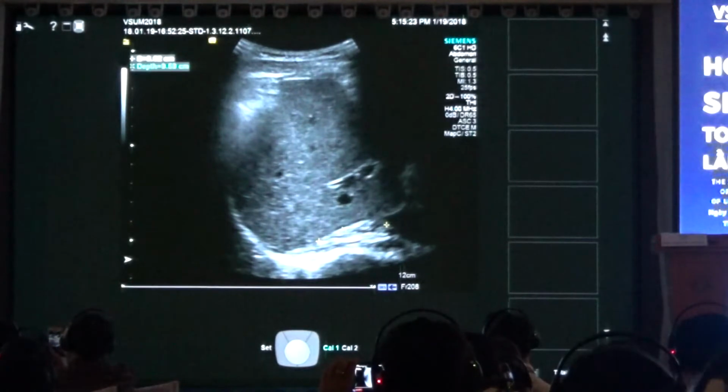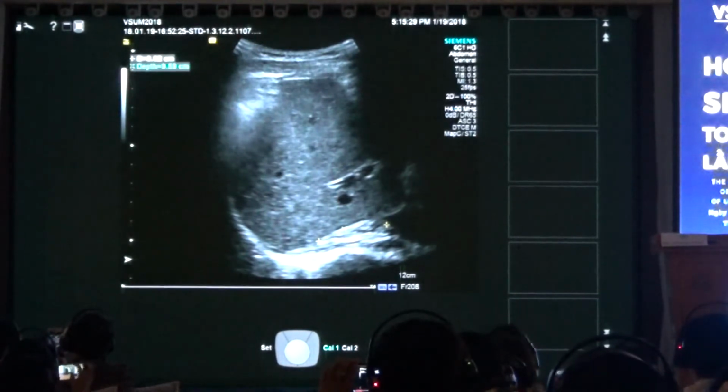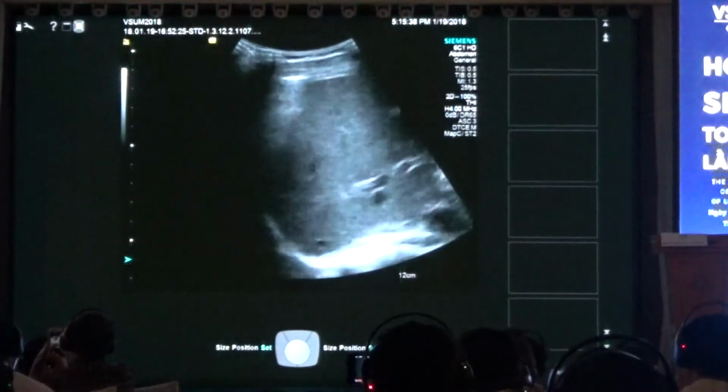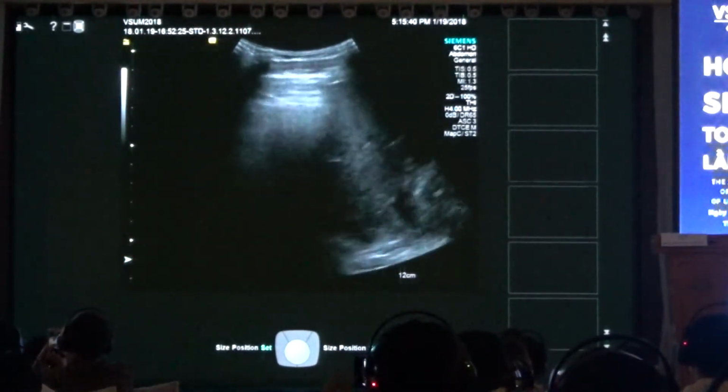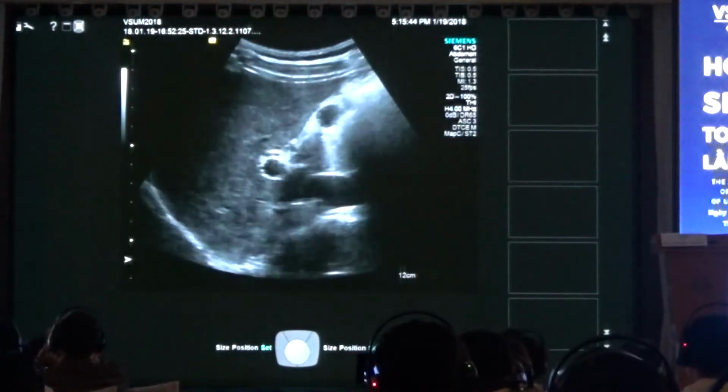I call it sometimes the position of 2 o'clock in the night. I'm on a night shift, and I have only one view to the patient, and I'm looking for different emergencies. So I'm looking for, okay, in this case it doesn't work, the gallbladder.